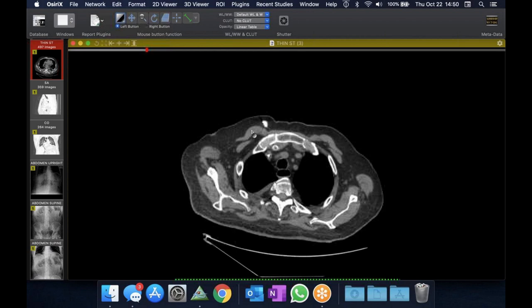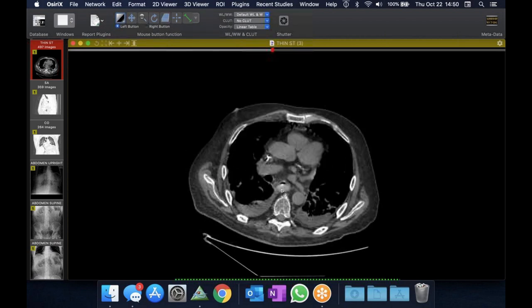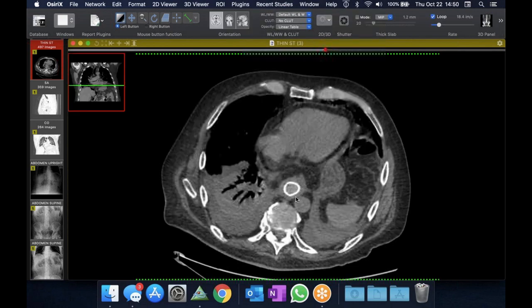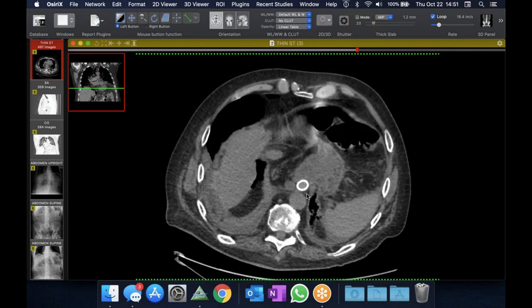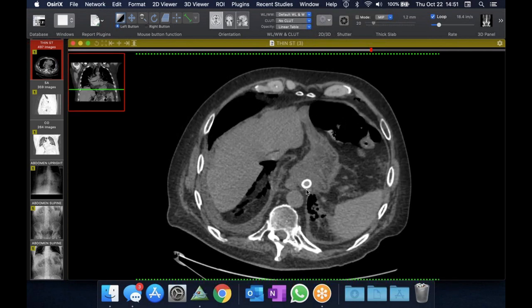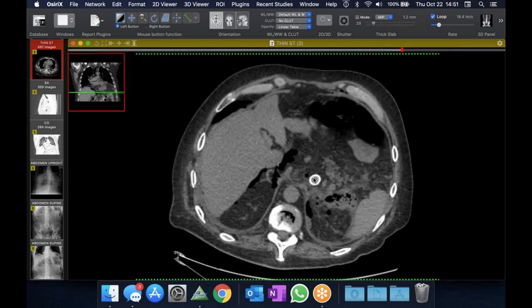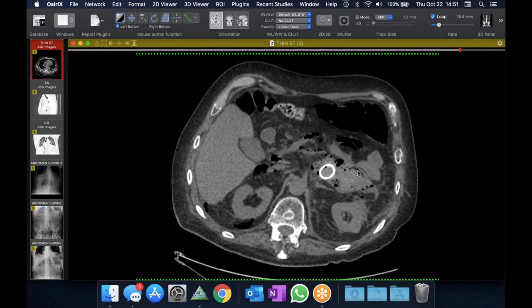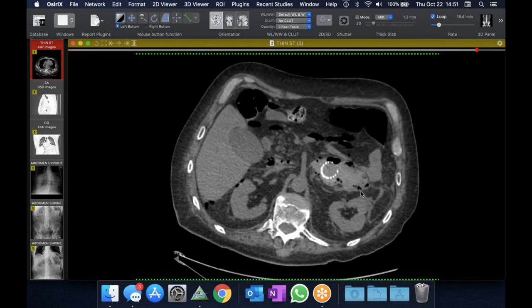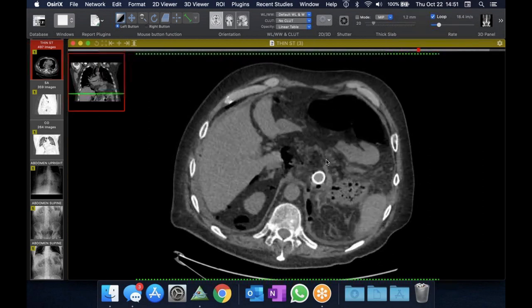Now, this patient also has some other findings I'll come back to, but you see there's some contrast still in the esophagus. And then here we follow the stent down. So here's the stent, and then there's the esophagogastric junction. And if you keep going down, you'll notice the stent doesn't really go in that direction. It continues laterally here and slides along the wall of the stomach into this abscess cavity down here in the upper abdomen, just anterior to the retroperitoneum. So this is a perforated stent.